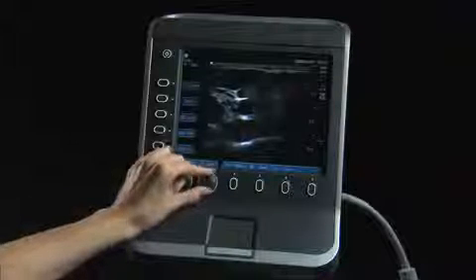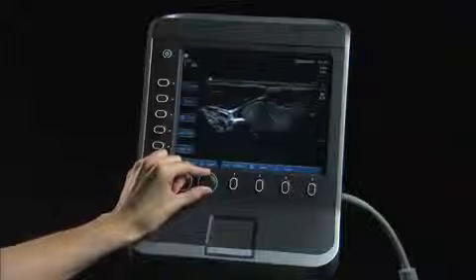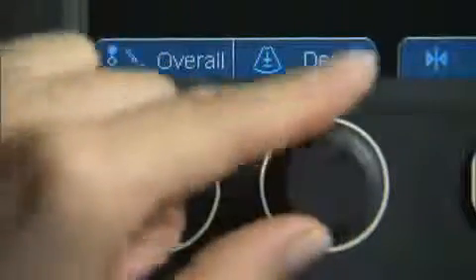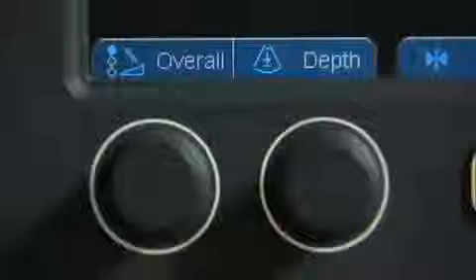The second knob is used for adjustment of imaging depth. Turning the knob clockwise increases the depth. Counterclockwise decreases the imaging depth. A beep sounds when the minimum or maximum of the range is reached.